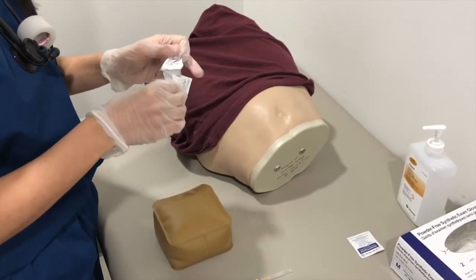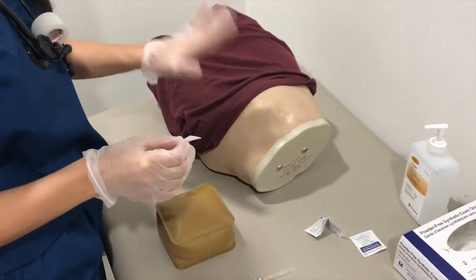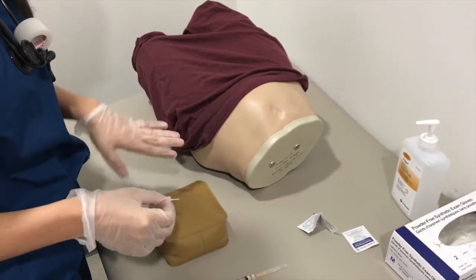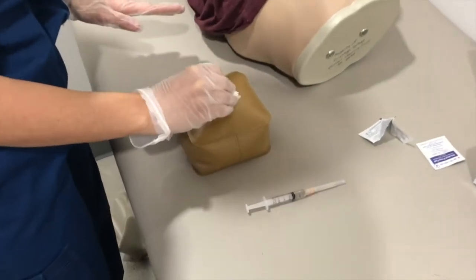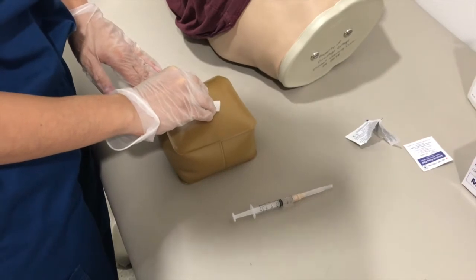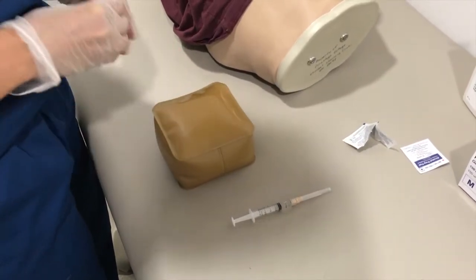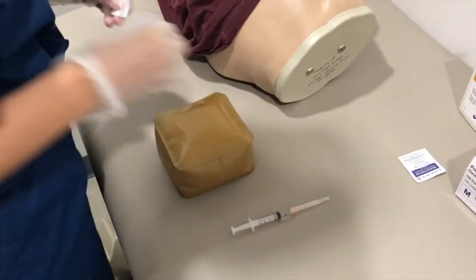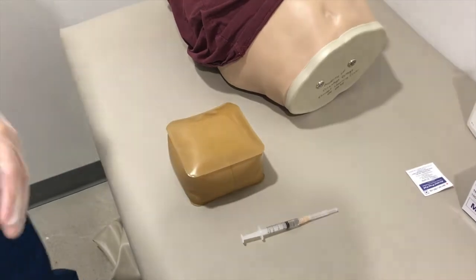Okay, Dwight, what I'm going to do now is clean the area before giving you the injection. So I would clean the stomach, but just for educational purposes, I'm going to be doing my subcutaneous injection on the injection pad. It's important that you start in the center of the area where you want to inject and go in a circular motion outwards. And also wait for the alcohol to dry, just to make sure that it's not going to affect our medication administration.